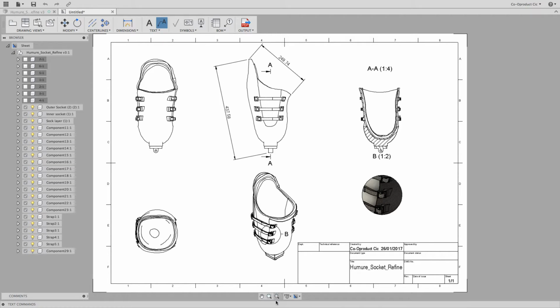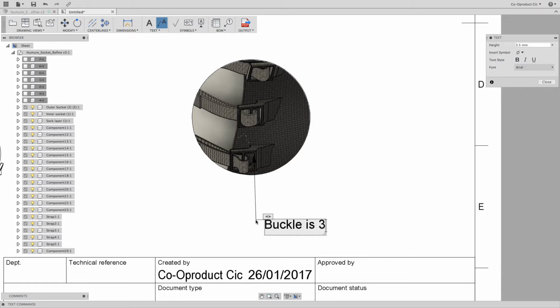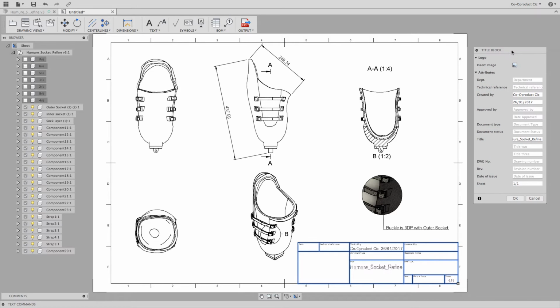Click Zoom Window, then draw a selection window over the detail view to zoom closer. Click to select the start point and draw the leader. And I'm typing a note here to highlight that the buckles are 3D printed along with the outer socket. Now click Fit to Window, and let's edit the title block. Double-click the lines on the title block to launch the dialog window.